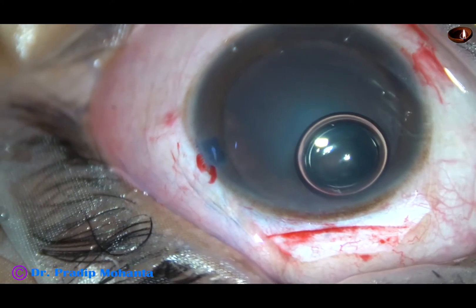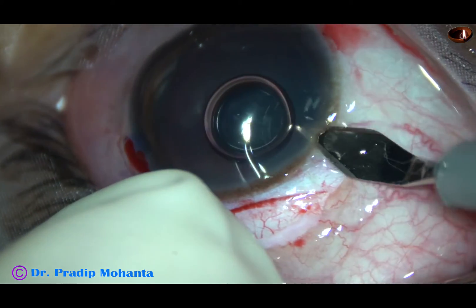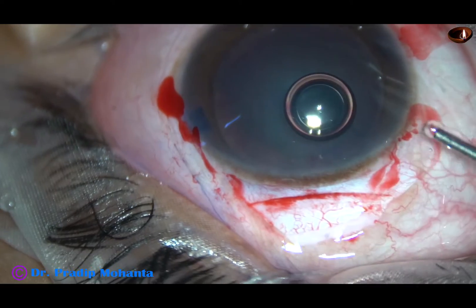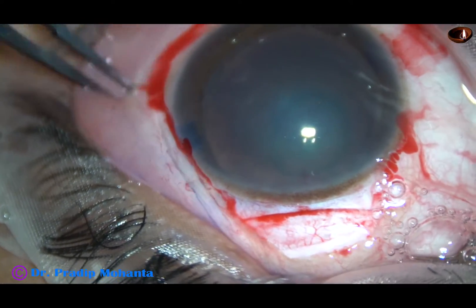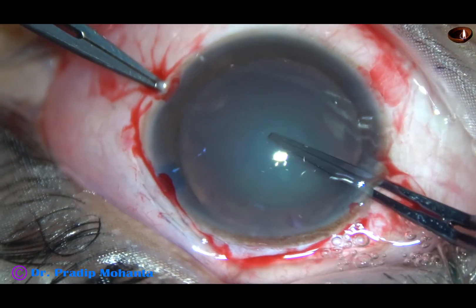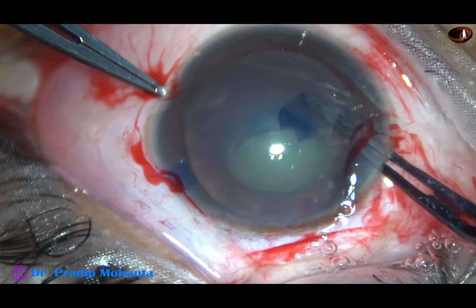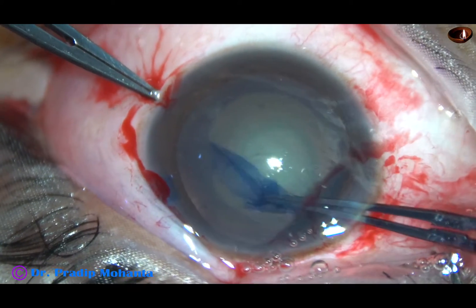In this case, I am going to make a side port incision at around 10 o'clock — a 2.4 mm incision. I am going to use this incision for various purposes. First, I am going to make a capsulorhexis through this incision with a utrata forceps. The rhexis is done.